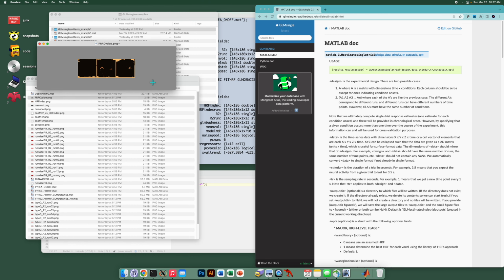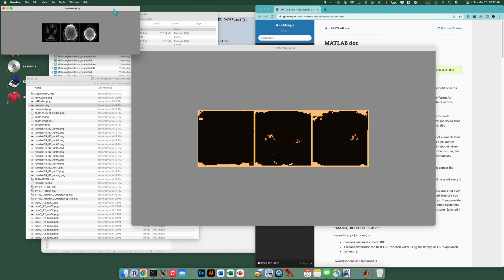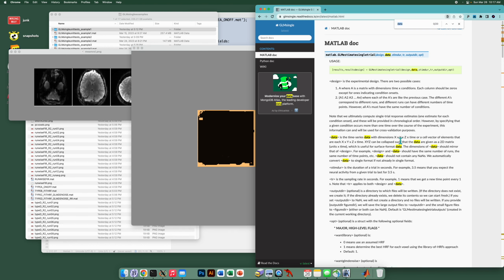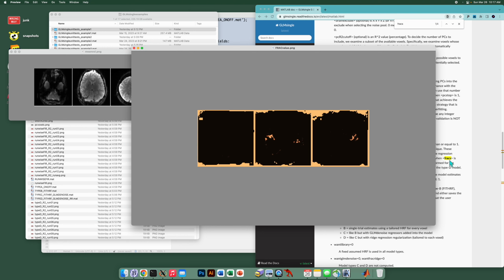Let's just start with the first alphabetical one, frac value. So this shows you, for just this data set, 3 slices taken from some fMRI experiment, and we're visualizing the fractional regularization level. It's a number between 0 and 1. 1 means no regularization, 0 means heavy regularization. Actually, the default in GLMsingle, if you look at the fracs input option, is not 0, which would mean infinite regularization. It starts at 0.05. So the range by default is 0.05, in increments of 0.05 up to 1, and here we're looking at that in terms of a copper color map.